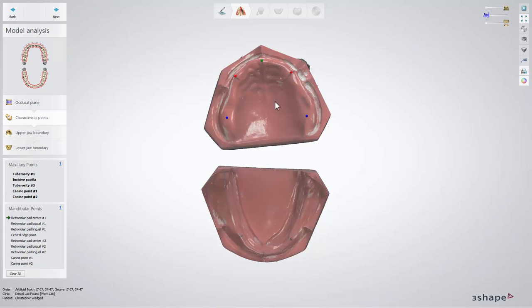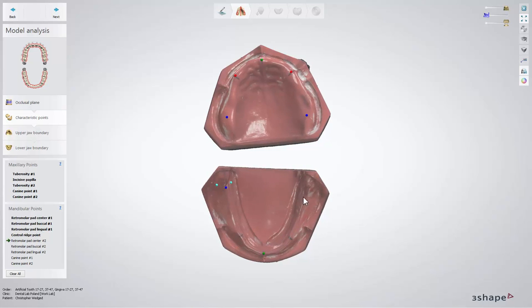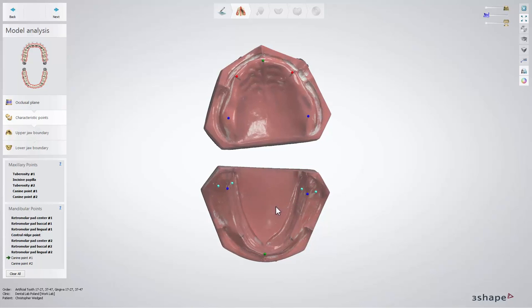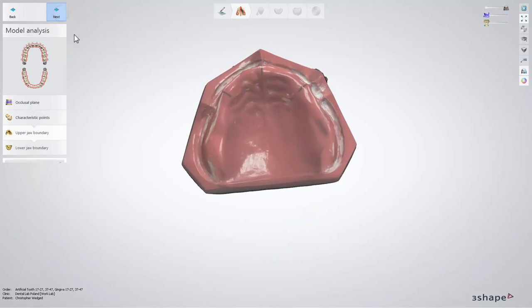Now let's select mandibular points. Start with three points for retromolar — center, buccal and lingual. Then comes the central ridge. Another three points for the second retromolar — center, buccal and lingual. And two points for canines. The position of canine points determines the teeth library selection, so they should be placed on the model in such a way as to coincide with the lines arranged by the dentist. When you are ready, click Next.